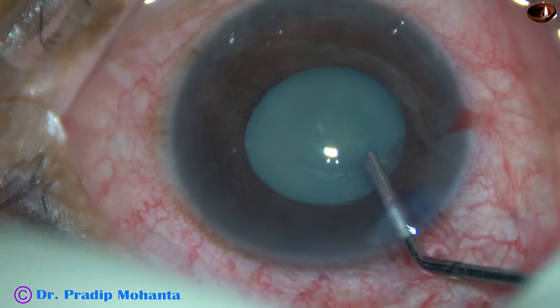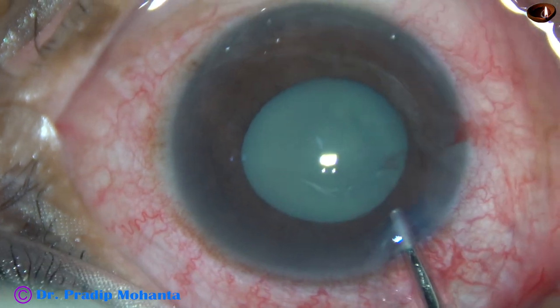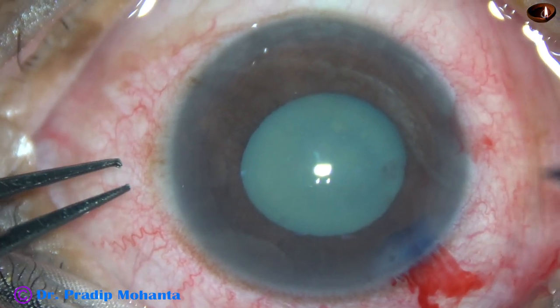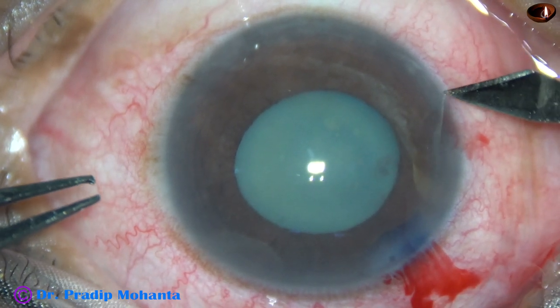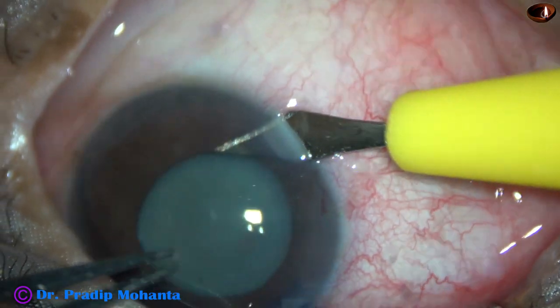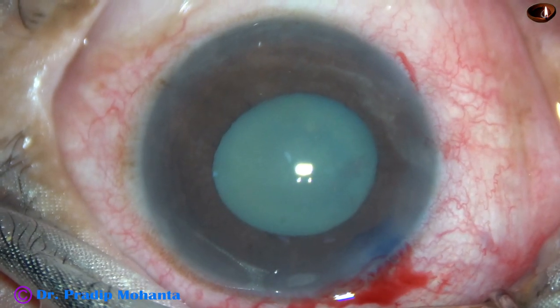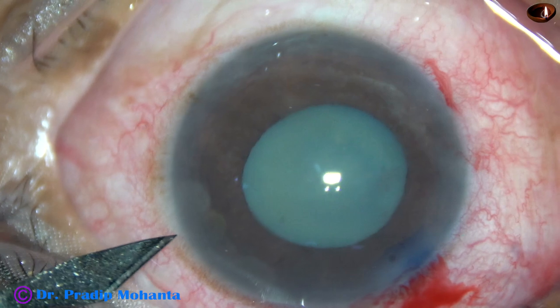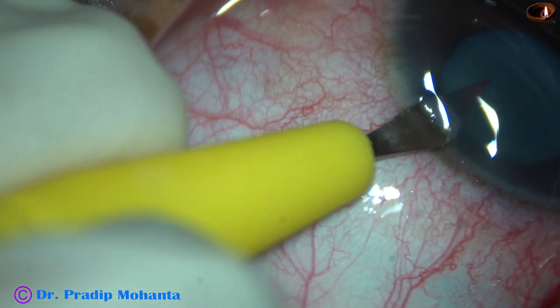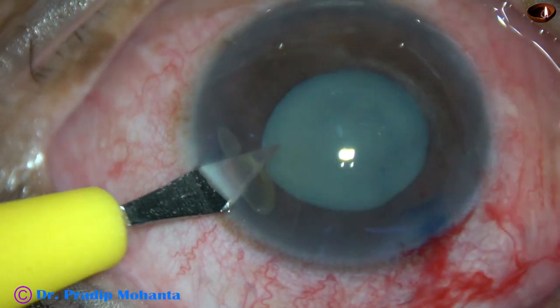Now this is viscoelastic — 2% hydroxypropylmethylcellulose. Now this is a side port on the right side of the main incision, about 3 clock hours away. This is another side port on the left side of the main incision, about the same distance away.